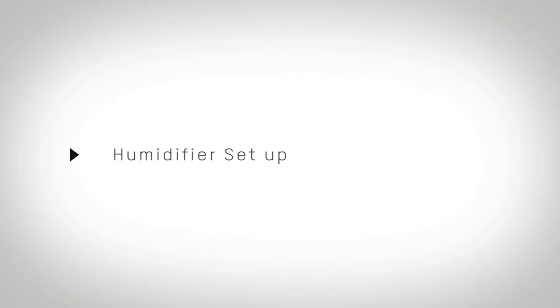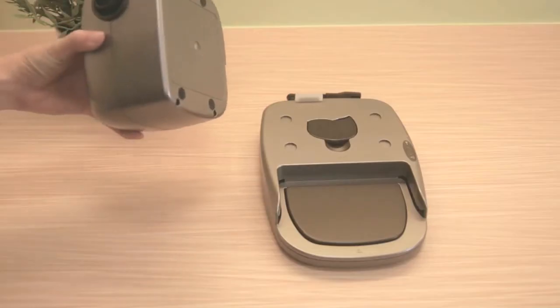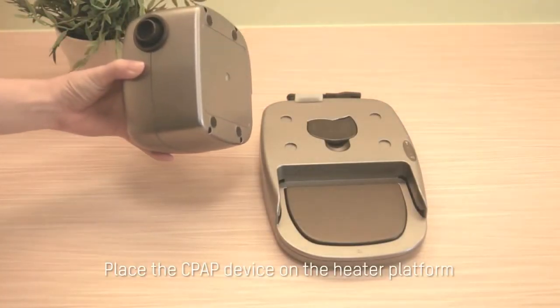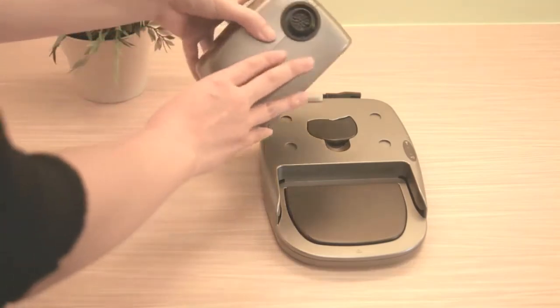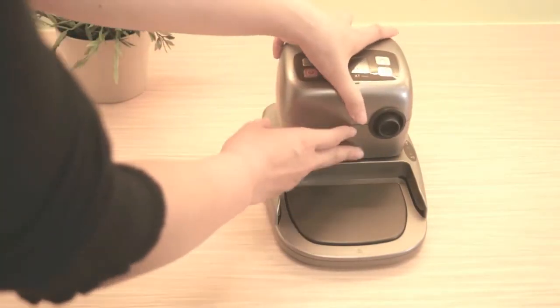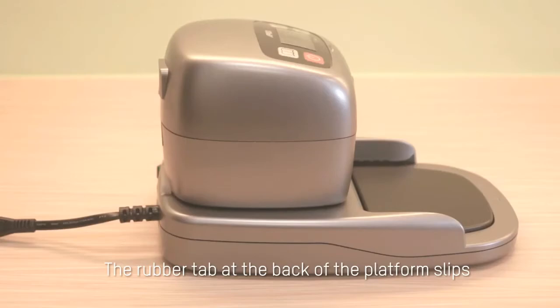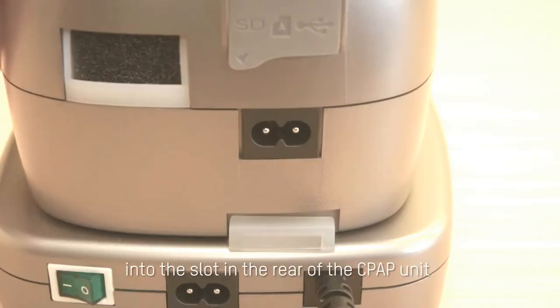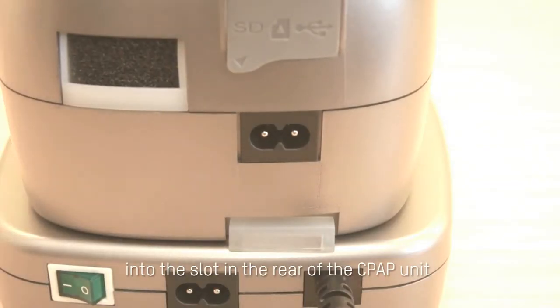Humidifier Setup. Place the CPAP device on the heater platform. The rubber tab at the back of the platform slips into the slot in the rear of the CPAP unit.